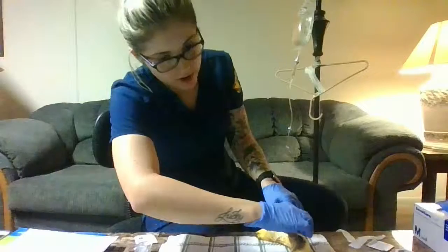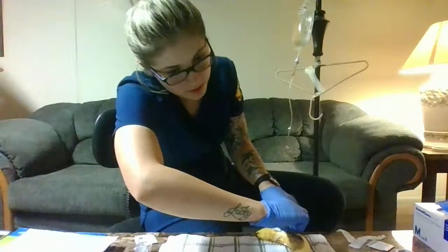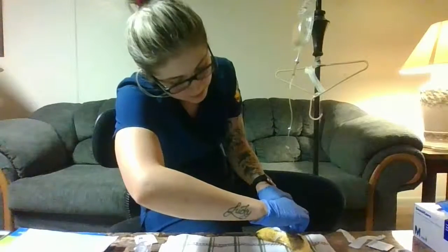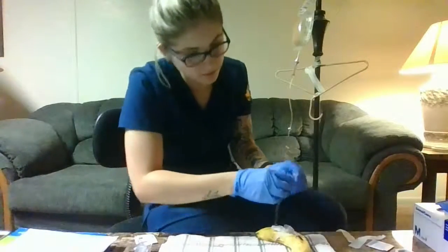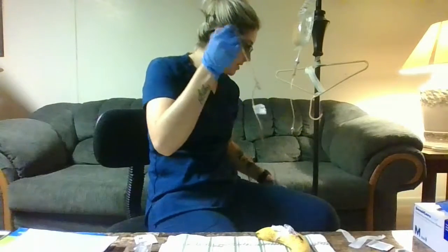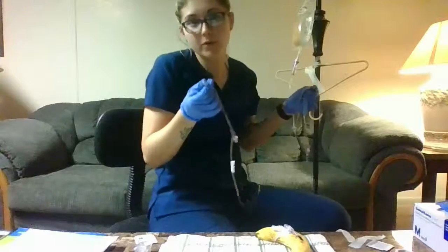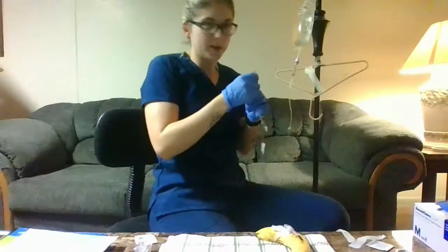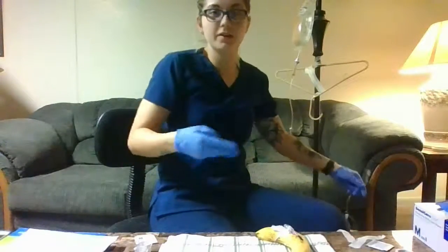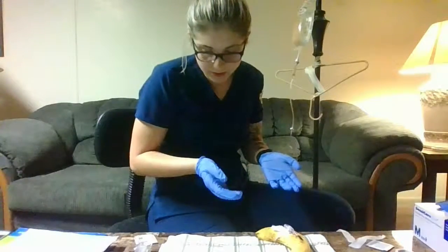Everything looks good. So we are going to remove the IV tubing. Before that, we would have clamped it before we removed it. In this case, there's a little bit left. Didn't want that running everywhere. Okay, so you have this here.